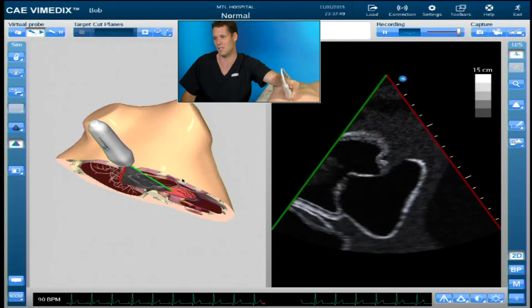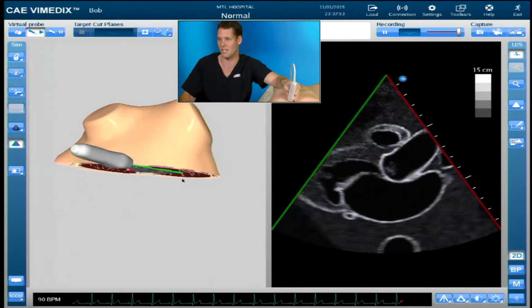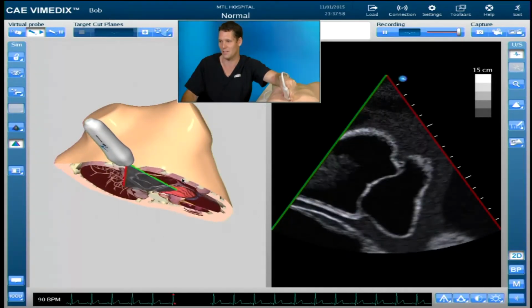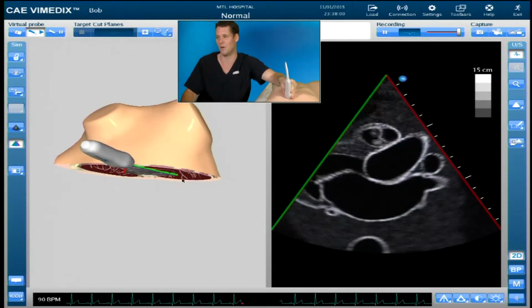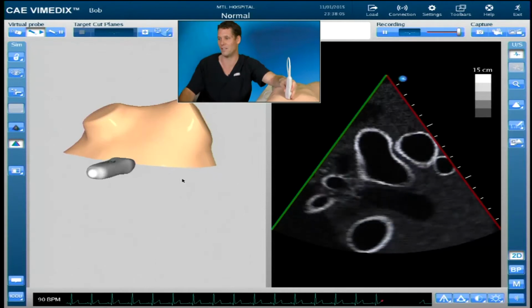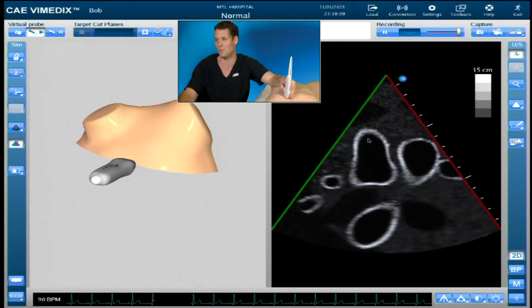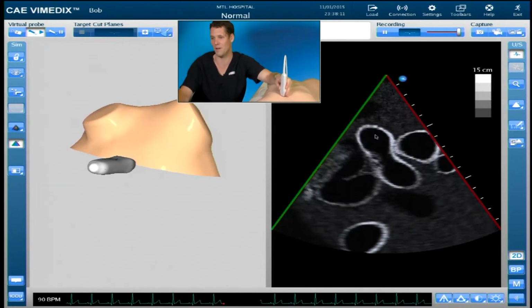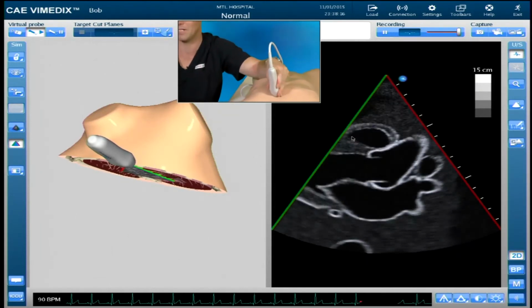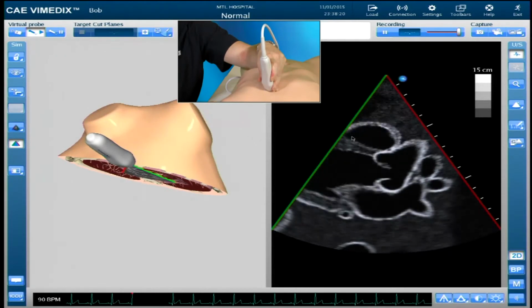And if you see that image, the movement you should be doing is starting to bring it back up to try and start seeing the aortic valve and the mitral valve. So if you're pointing too far down that way, seeing the tricuspid valve, you need to bring it back up. Alternatively, if you're pointing too far superiorly, you can often get an idea of this is the pulmonary valve that you can see just starting to come in. And if you see the pulmonary valve up there, you know you need to fan down a little bit, pointing more towards the patient's feet.